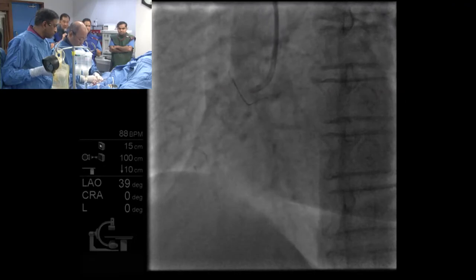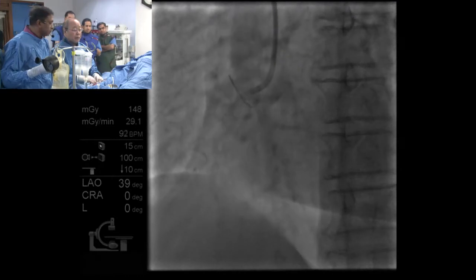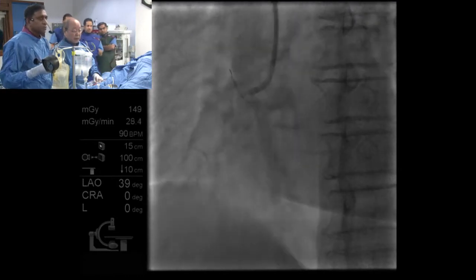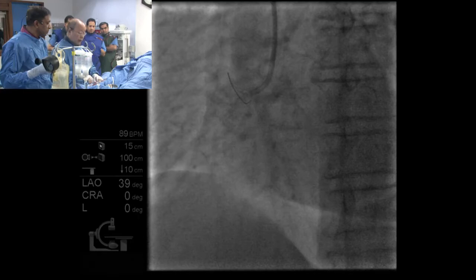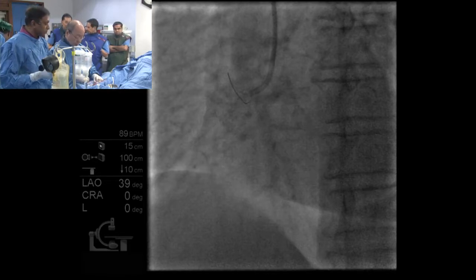Dr. Saito, why don't you use two catheters? Do you have one catheter here or two? One catheter, because we removed the left coronary catheter, because that provides no information. That means no collateral. And also there is some septal connection, but that route is too tortuous.